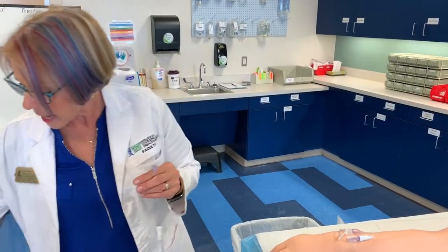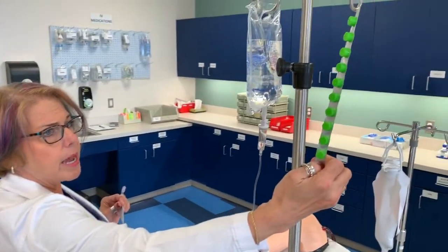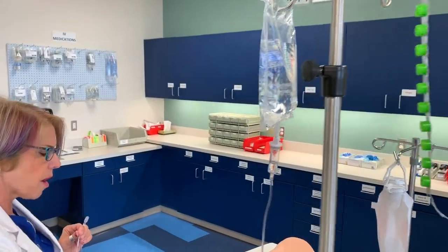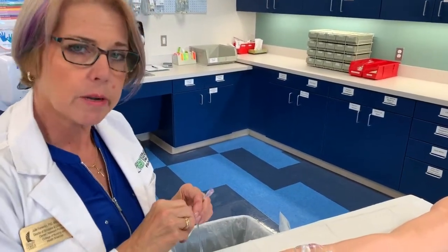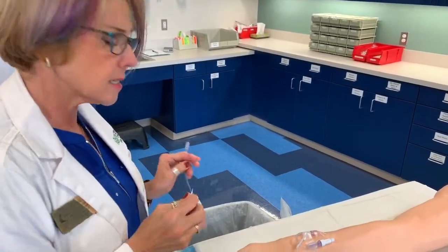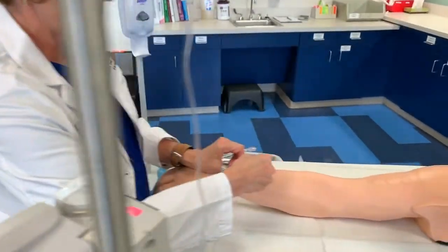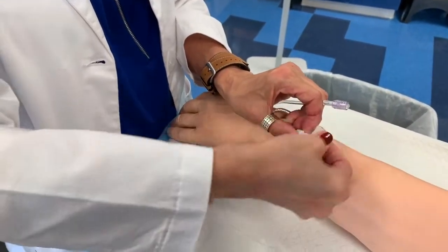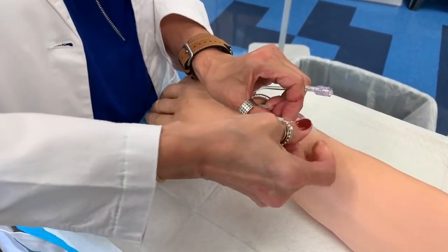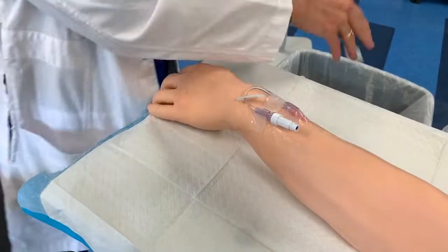Now, we need to attach this to our patient. So if we had one of the Curos, you see these green caps? If we had one of those caps on top of our port here, and it's been there for at least 2 minutes, then we don't need to cleanse the site. But since this doesn't have one, we're going to go ahead and wash the site and make sure we scrub that hub very carefully. And you want to make sure, because anything we put on here, if there's any bacteria or problems with it, we're going to be instilling that right directly into our patient.